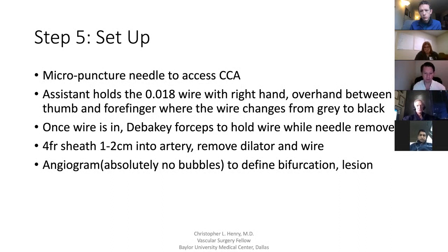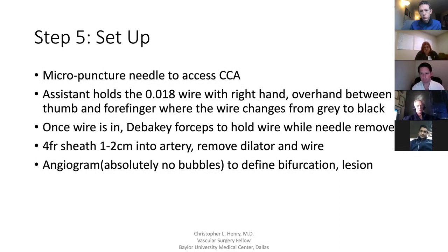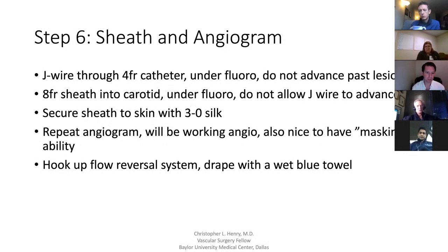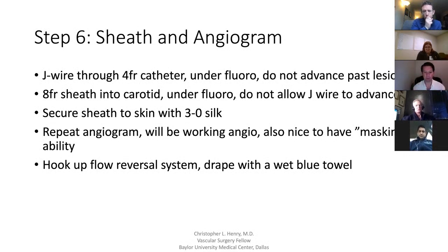Once the wire is in, he typically uses DeBakey forceps or a special titanium forcep to hold the wire as he removes the needle, then put in the 4-French sheath, take out the dilator and wire, and shoot a scout angiogram. Ensure there are no bubbles in the contrast — this gives a road map and a line to not cross when coming in with the J-wire. The rep in the room will mark that on the screen. Then advance the J-wire through the 4-French under fluoroscopy, and the rep marks the line; you don't go past that line as the operating surgeon is passing the 4-French catheter and exchanging for the 8-French sheath.